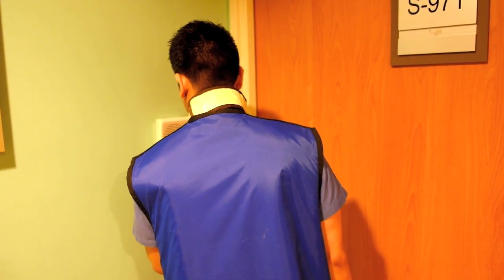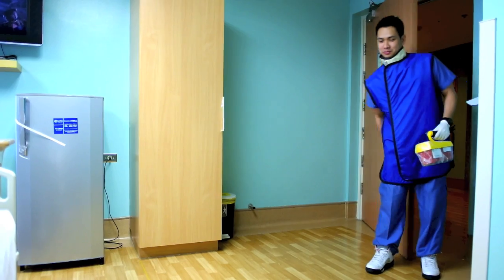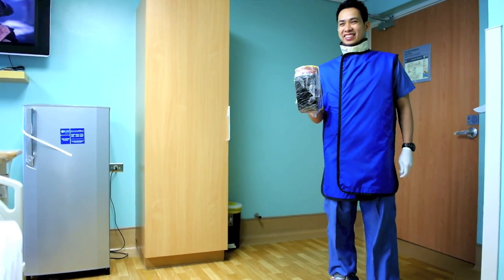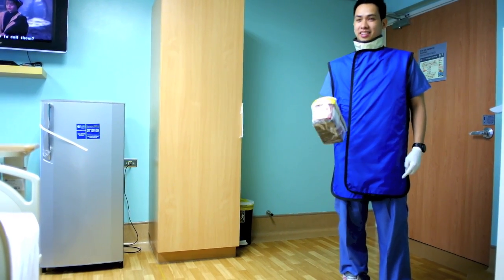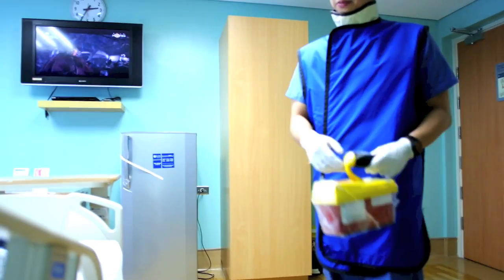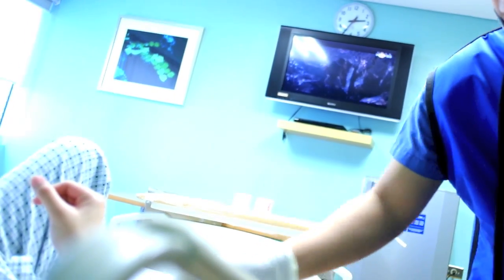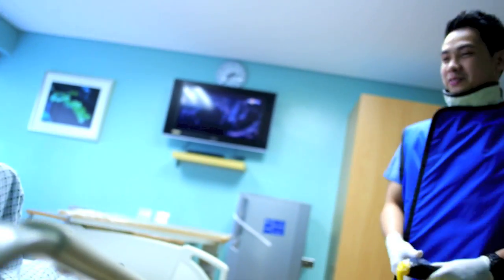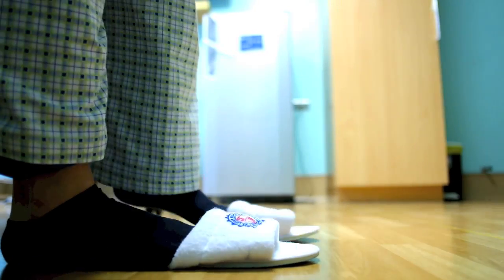The nuclear medicine technologist shall perform radiation dose rate monitoring daily with the use of a radiation survey meter. When performing the radiation survey, the patient shall be measured 1 meter from the midsection, whether standing or lying down.